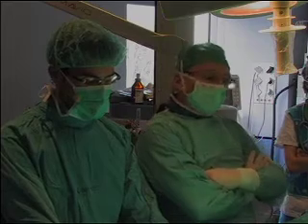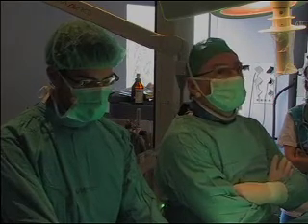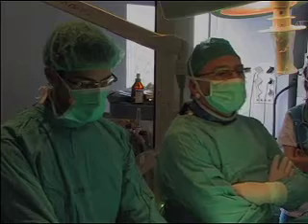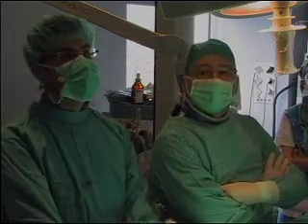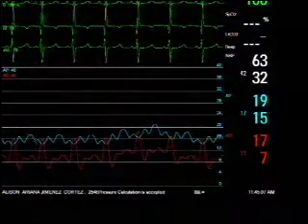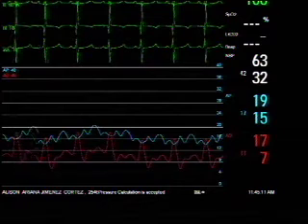So our first surprise was about the pressures. I think you can see the pressures there. Can you? We can't see the pressure monitor at the moment. Okay. Can we see? Now we can. So the pressures are not so high.